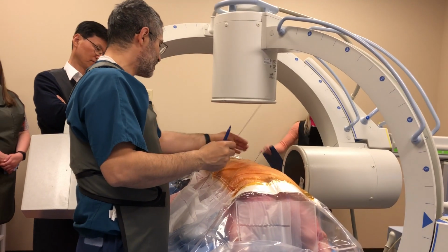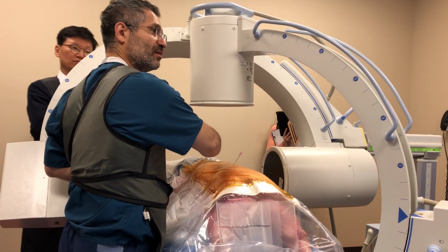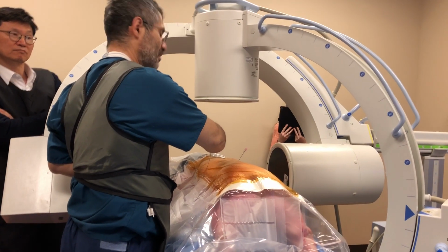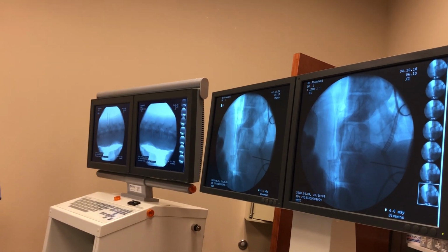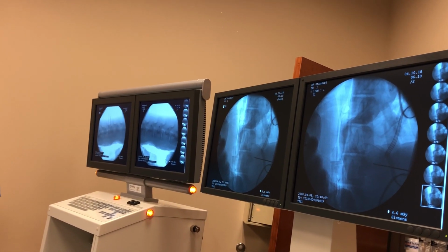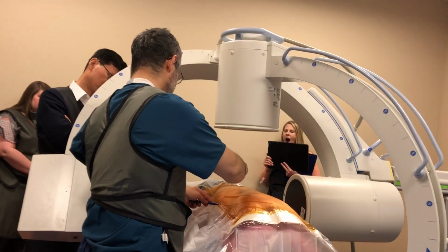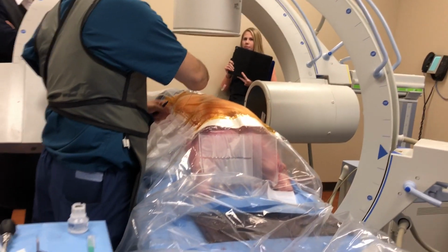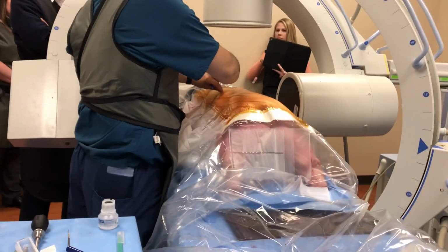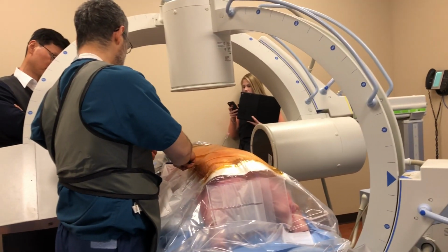So I have my midline, I have my trajectory. The next step is lateral. I need to have a good end plate. X-ray. And I try to put it in the midpoint of the disc. X-ray. About that. Now, I mark the point here, and we call this the dome. I mark the dome. I put my finger here at the dome. Then I know from the dome I need to go that far down to be in the midpoint of the disc.